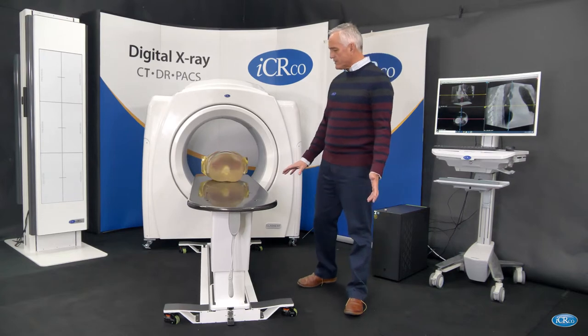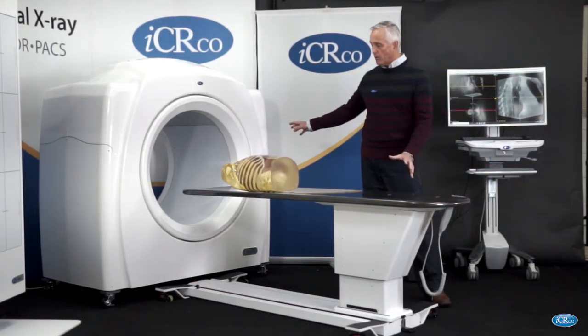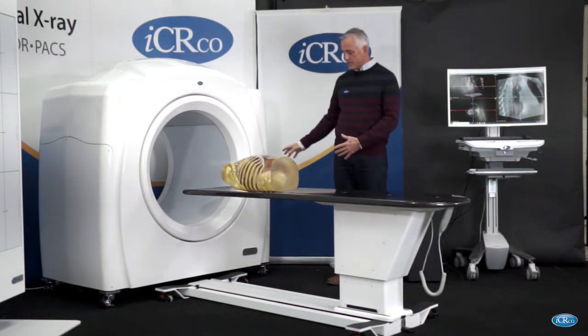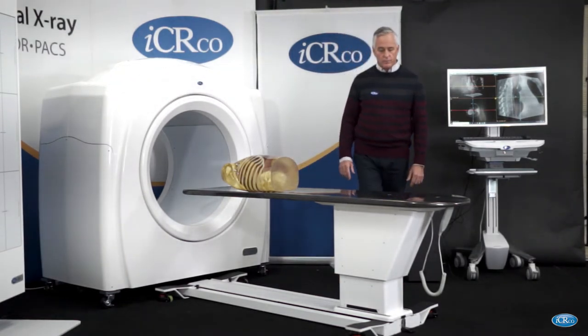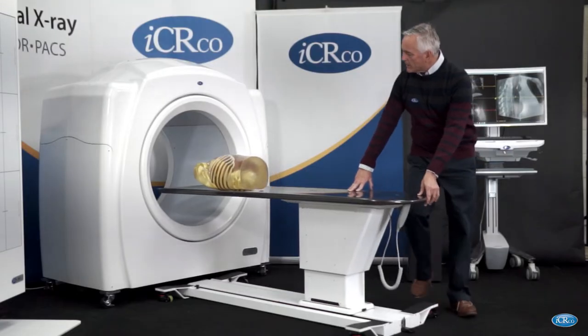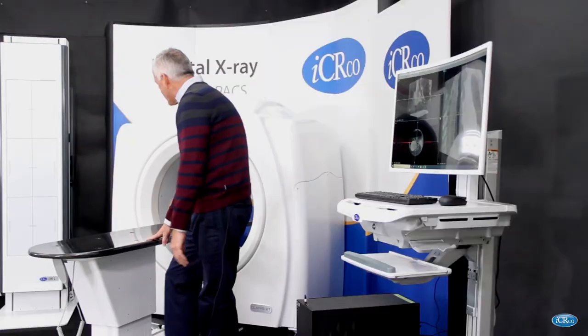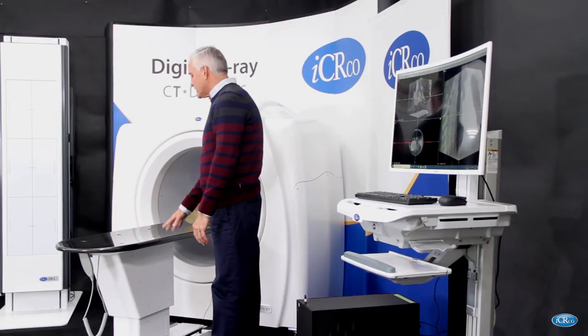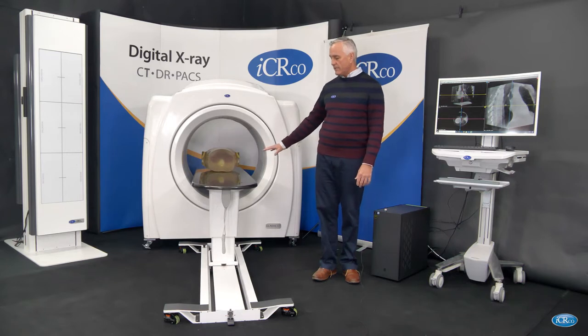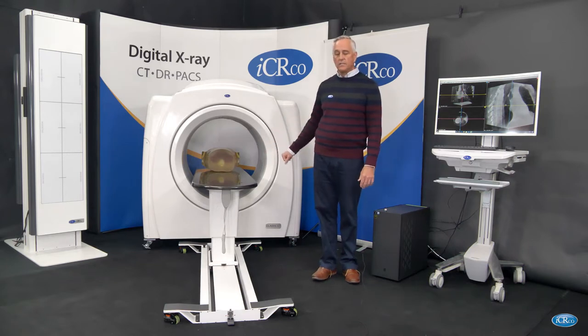The workflow is very simple. We have a completely mobile, portable CT system. The entire system is on wheels and can be moved around. There is a locking device for the table. If I want to move my patient into the CT, I move the patient in manually and then leave it in place for the CT, so I don't have to have the table moving in and out during the exam.